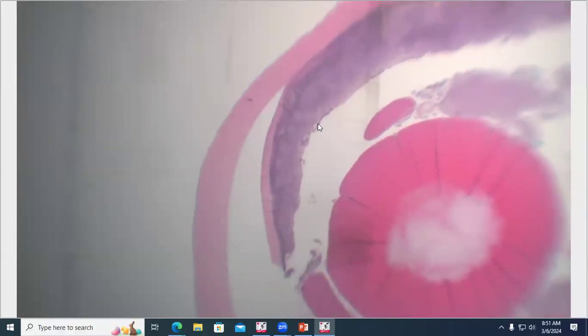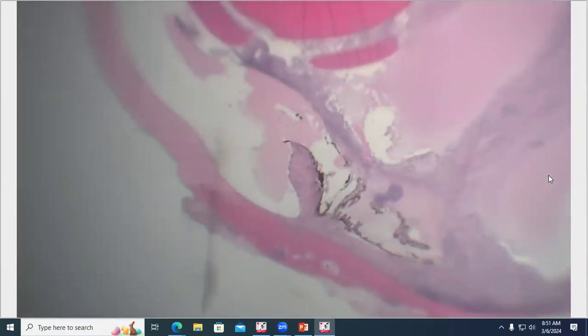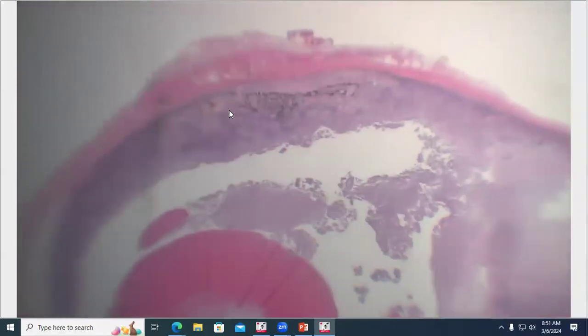So here's our cornea on the right. Here's our really thickened and anteriorly positioned iris leaflet that we were seeing before, and that had that mass effect clinically. And this one is a little bit more busy than the last one we looked at, but still in the anterior chamber, there's mostly just this high protein fluid, so this eosinophilic material. And most of the actual inflammation is behind the iris and posterior chamber, and along the choroid and affecting the retina, really severely distorting the retina. That said, just an overall much more inflamed eye than the last cat that we looked at.